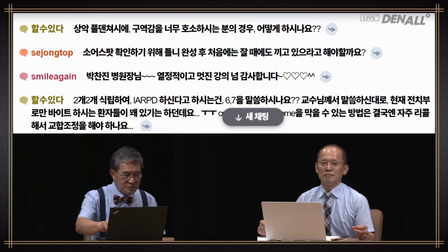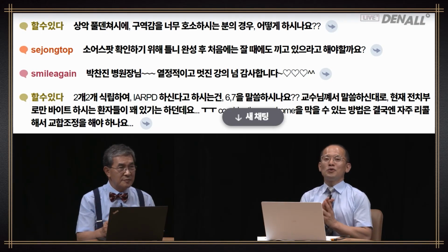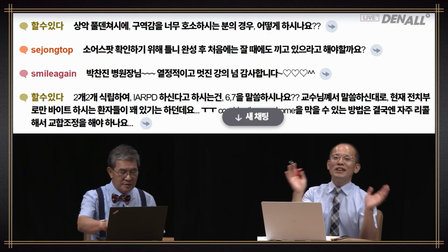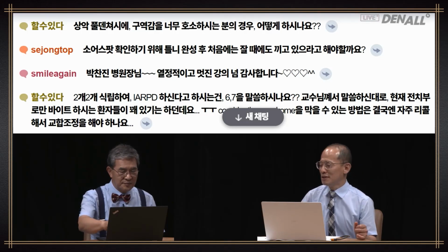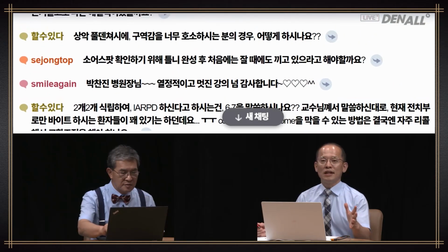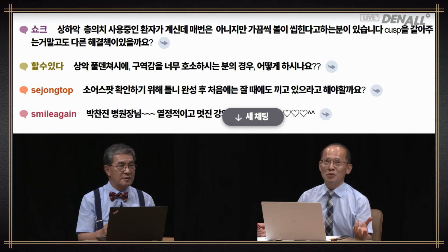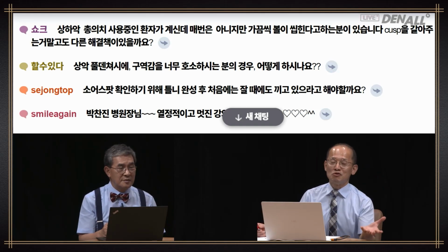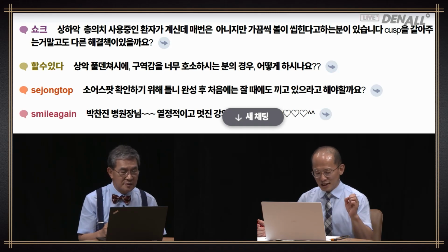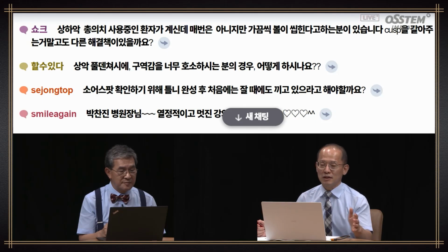And then in the case of a maxillary full denture, if the patient has nausea and vomiting, what to do? How to resolve that? Actually, in trying out and in bite taking, if there's nausea, or if the existing denture is a problem and the patient really complains about discomfort, then indirect lining is something I consider.